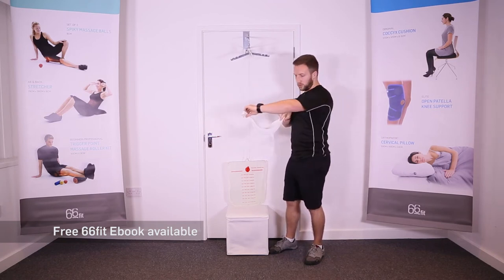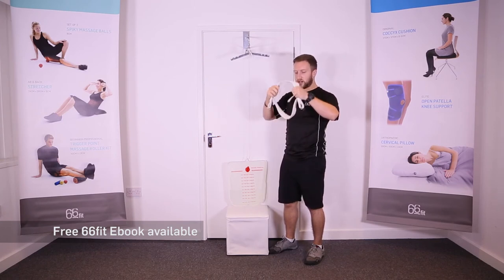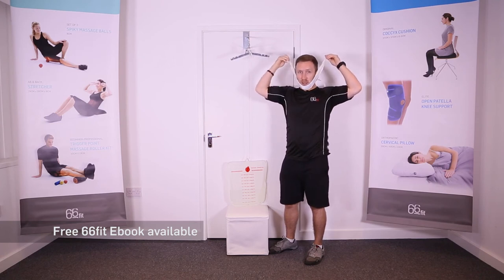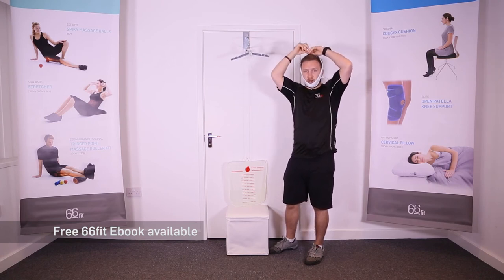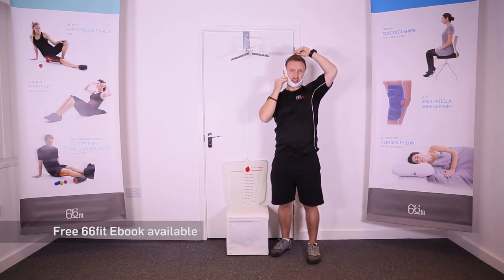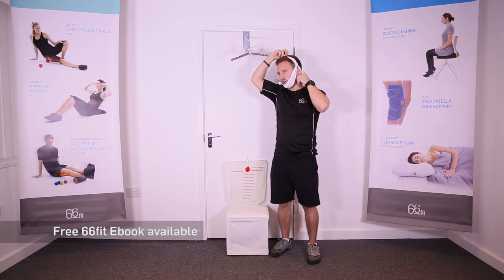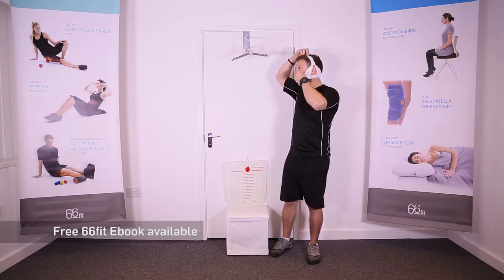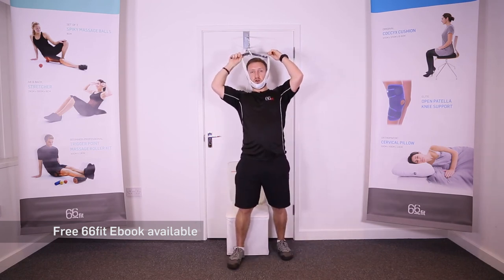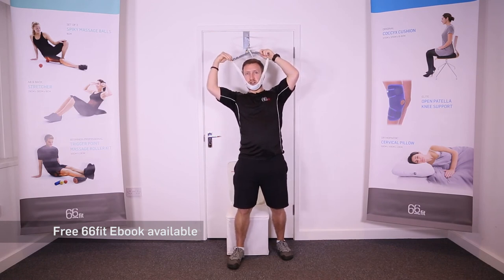You want the velcro straps here at the back because they're going to go behind your head. Pass them up and over the top and put your chin in the chin straps, then pull these up and hold them in place with one hand. Take the straps and stick them on each side, then line these up with the notches on the bar. Put them in the first notch on either side.